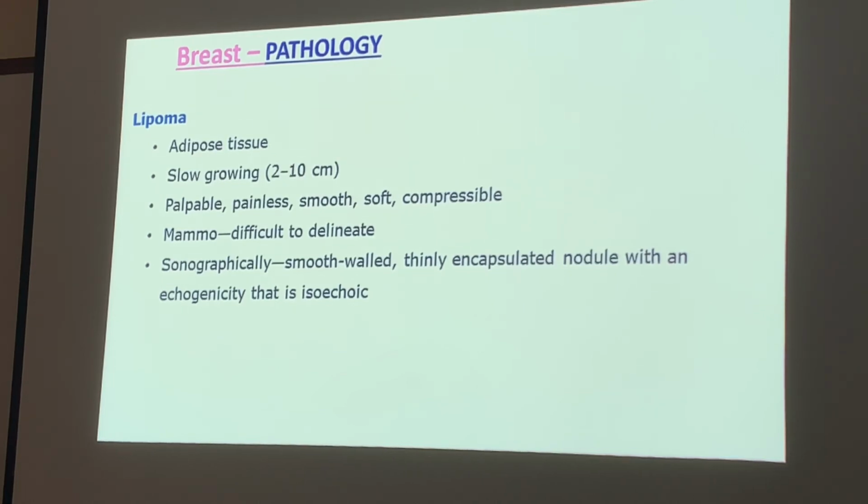Is that by the book? Because yesterday we had a renal, what was the saying? You should measure the big ones, but if you want, you can also measure the little ones, and measure from different areas of the organ. That's why I say the largest three. It's kind of like the standard. If they're just three huge ones, I'm going to measure those. But if it's just three and they're all over the place, I'm going to take a superior, mid, and inferior lobe.